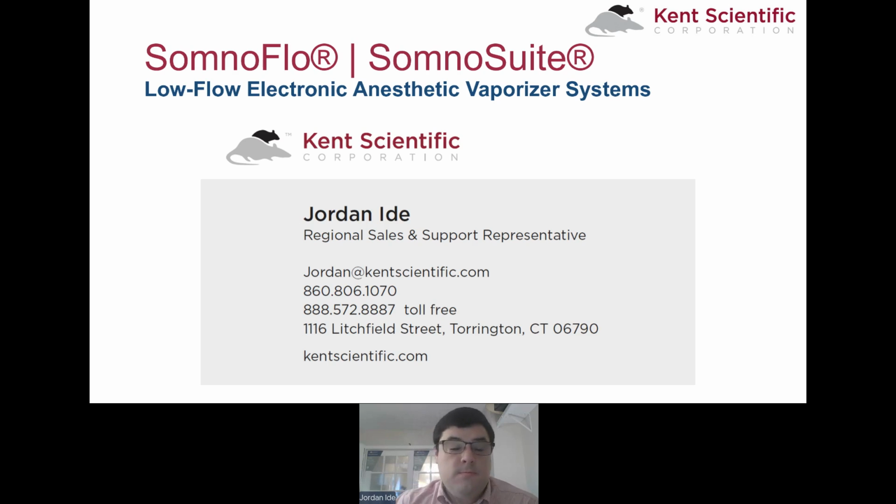So regarding anesthesia only, so not focus on monitoring, what would be the main difference between the Somno Flow and Somno Suite? Sure. The main difference between the two is the way the isoflurane or anesthesia is delivered to the system. So on the Somno Suite, it comes with a special bottle top adapter that you can attach the syringe to and then fill it up. And then you would put the syringe in the system, placed in the pusher block, and then attach that little tube on the front to the syringe. While on a Somno Flow, you just attach the bottle directly to it, and then it takes care of the rest for you once you power it on.